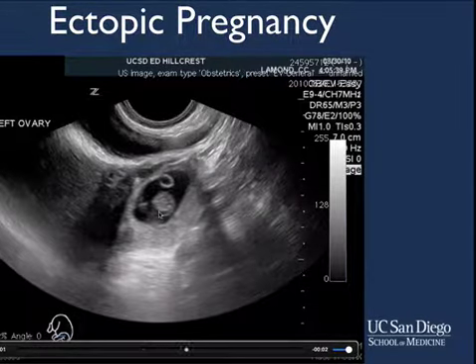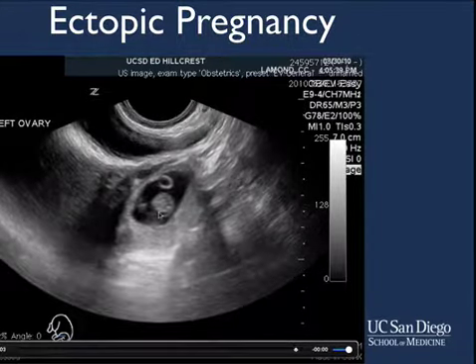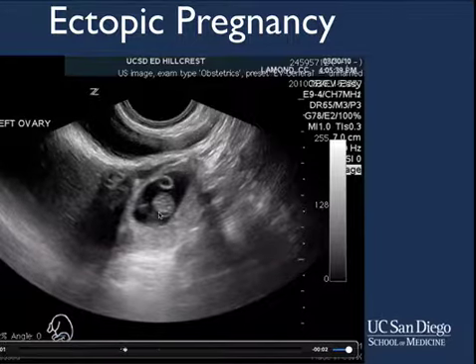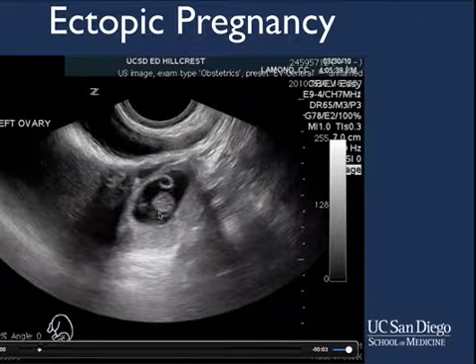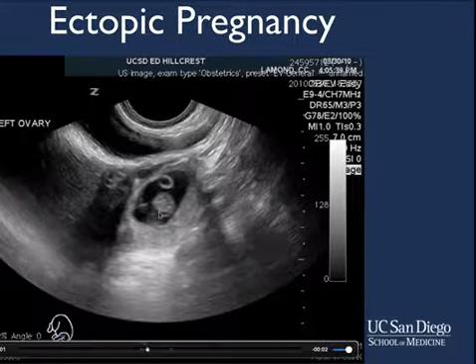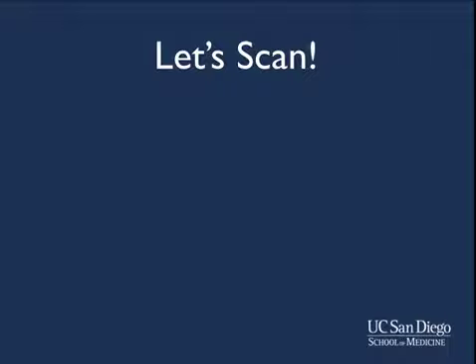This is one of the main uses of pelvic ultrasound, and this leads to a quick diagnosis of a life-threatening disease. So there are many important uses of pelvic ultrasound, and today we will learn how to see the anatomy of the pelvis. So let's go scan.